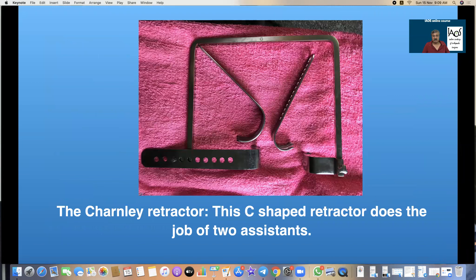The first instrument is a Charnley retractor, which is a self-retaining retractor where the distance between the two clamps can be varied. This does the job of two assistants.